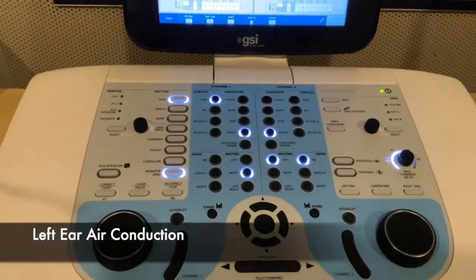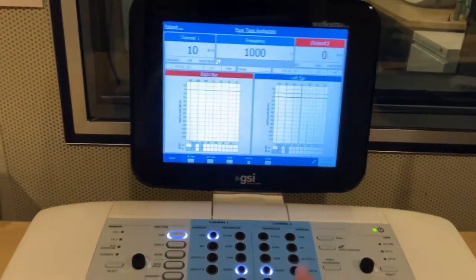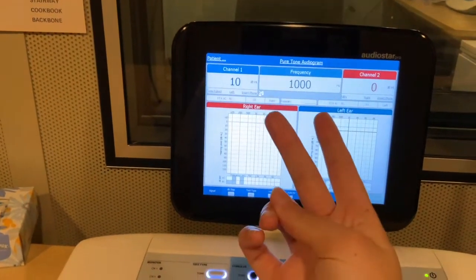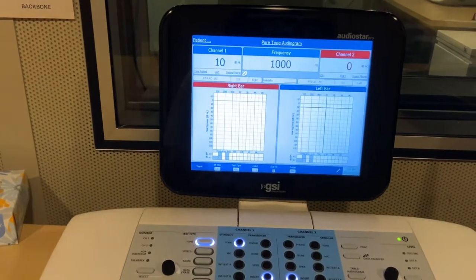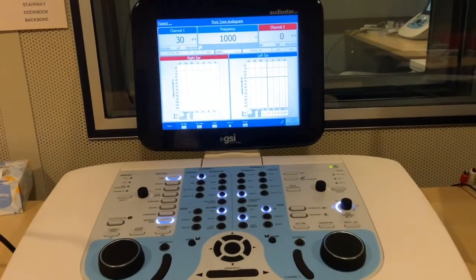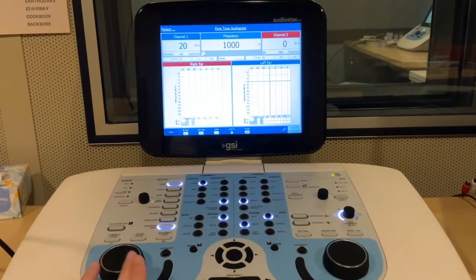Now let's switch to the left ear. We're just going to go to the routing and we'll press left. And so that'll switch over. Before the crosshairs were over on this side, now they're over on this side. And these two channels swapped. So we can still use the same knob to adjust the decibel level in that ear. Again, let's start at 30 dB and present there, see if we get any response. Okay, as we did before, let's go down 10 dB at a time.